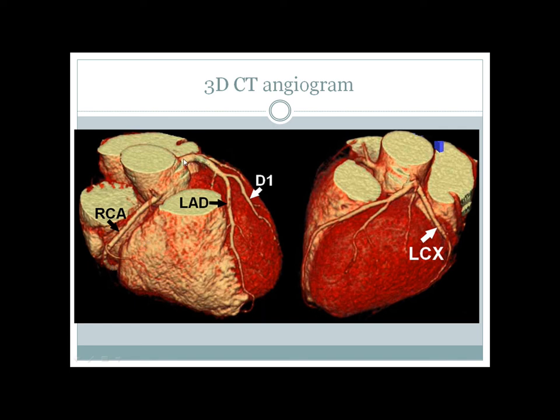Here you can see the left coronary artery, or left main artery, giving off the LAD running from here towards the front in the anterior interventricular groove, giving off septal branches — here is a septal branch, diagonal 1, probably this is the diagonal 2 branch. The one running behind is the LCX. Rotating the view, this is the LAD running from the main coronary artery towards the anterior interventricular groove, this is D1, and here is the LCX. Probably this is a ramus branch and this is the LCX running behind.